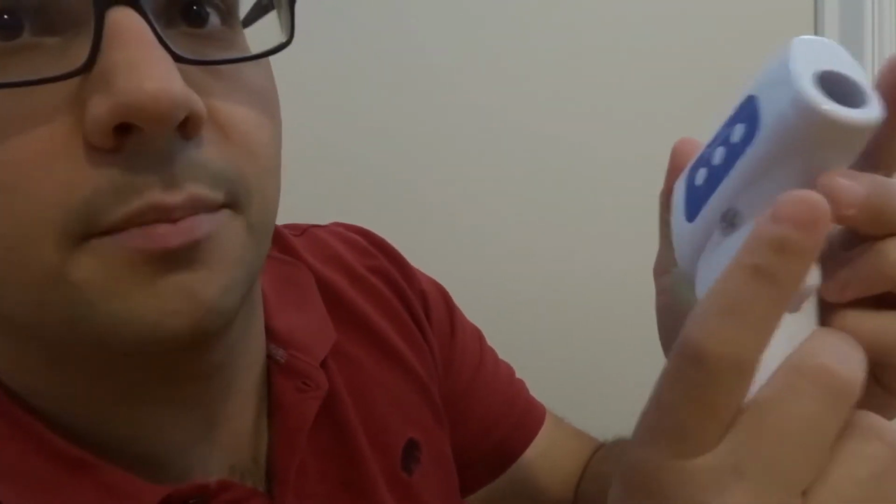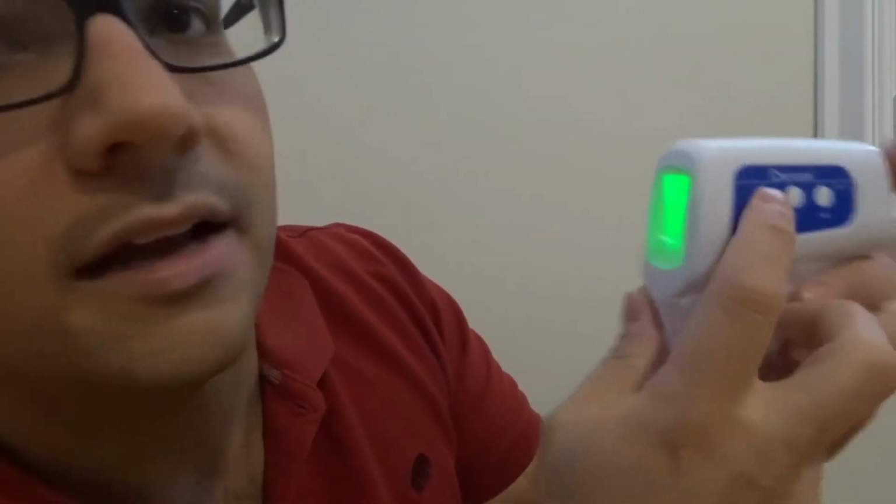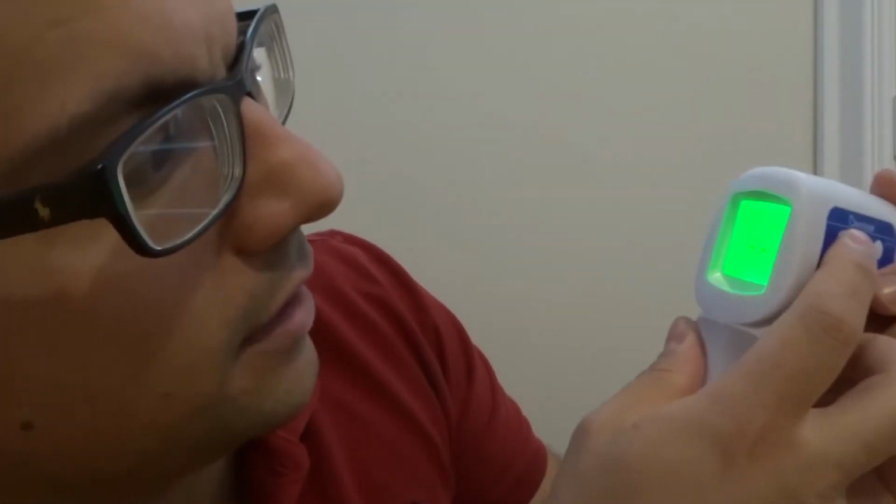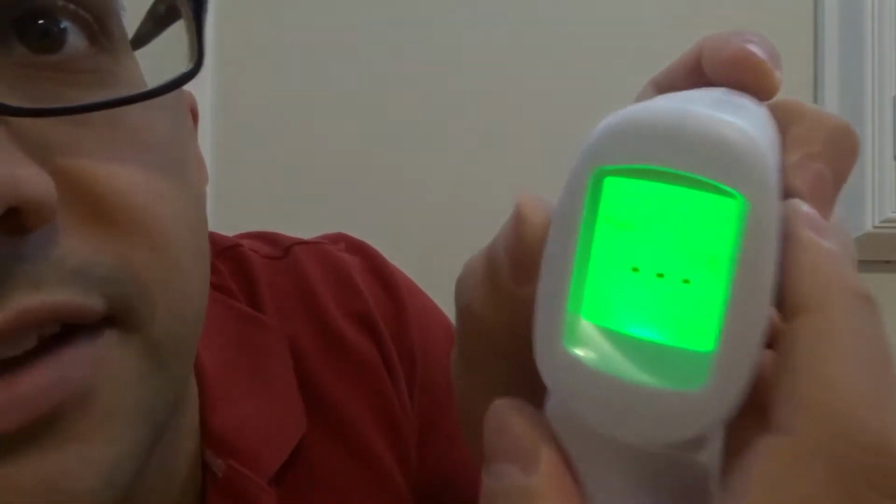And then you have your mode option, which is great because your mode is going to cycle through the modes. I'm going to turn it on so you can see what we have here. So to turn it on, I'm going to push that main button right there. Sorry about that. These buttons, I believe, don't turn it on. But for your mode options, we have room, so I can measure the temperature of a room.